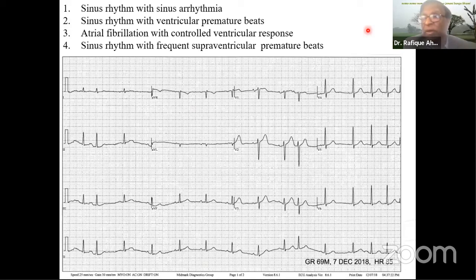I mean, the majority of people are answering correctly, and I'm sure if we continue, we will have close to 100% correct answers. So is it 30 seconds now? All right.